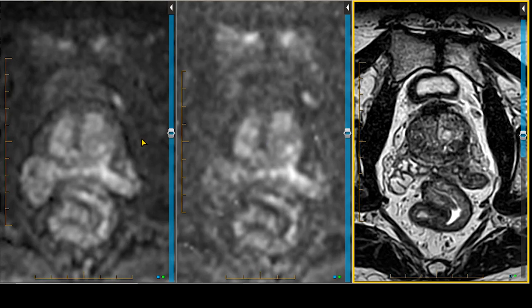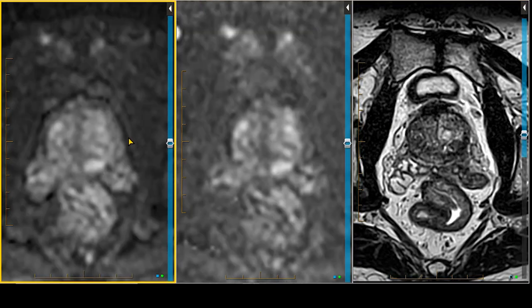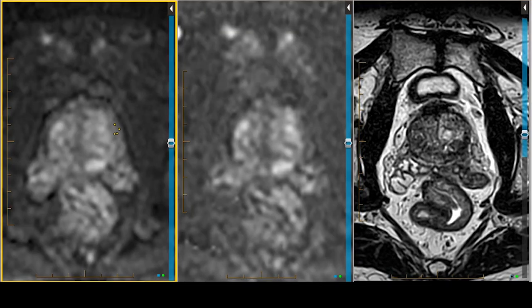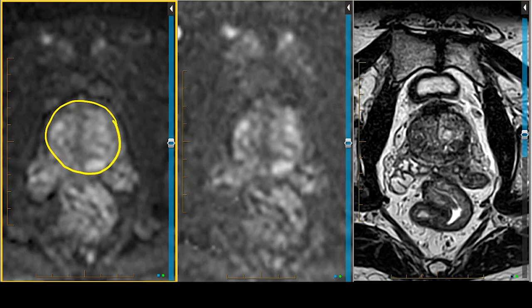Dr. P here giving you some updates on PI-RADS 2.1. Starting with something simple — as I scroll here, I'll use my trusty pencil with the color yellow to draw the prostate outline. Right there, snuggled up against the midline, is a slightly brighter area on the diffusion image in an area we're now going to map out as PZPM, or peripheral zone posteromedial. You can add that to your armamentarium of descriptors.